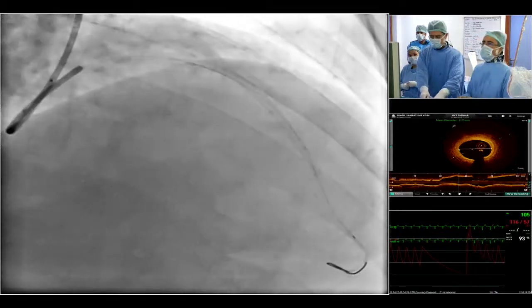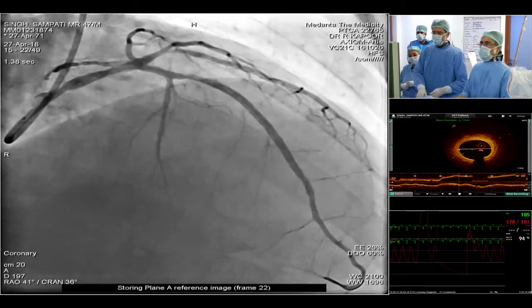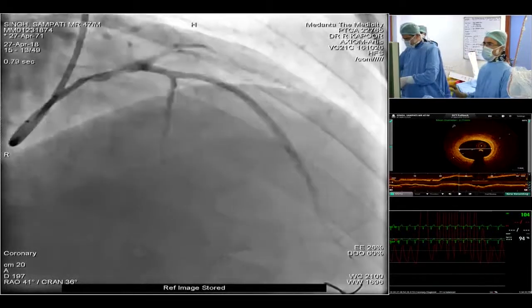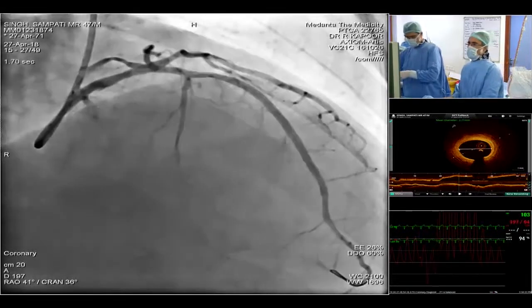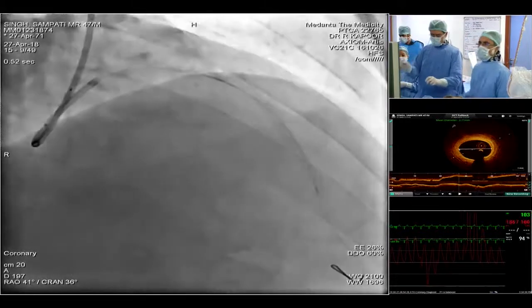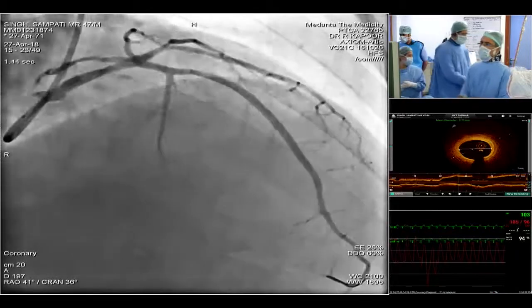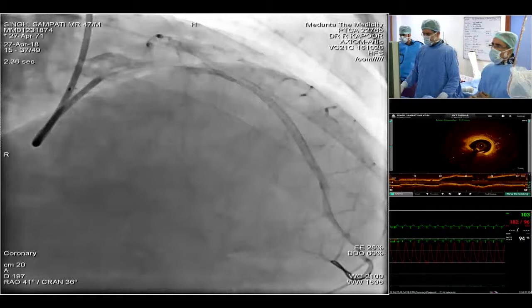So this is how it looks after stenting, but still, as I mentioned, a lot of work to be done with post-dilatations. So let's have a 3 millimeter, 3.8, 3.0 into 8 millimeter non-compliant balloon. And then keep the FFR ready. While we've done this, we'll do the FFR.